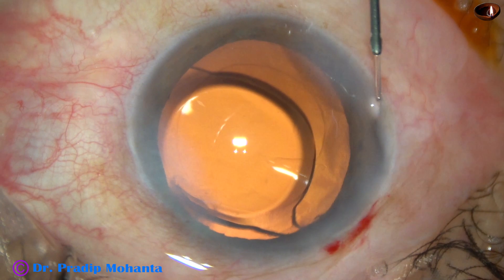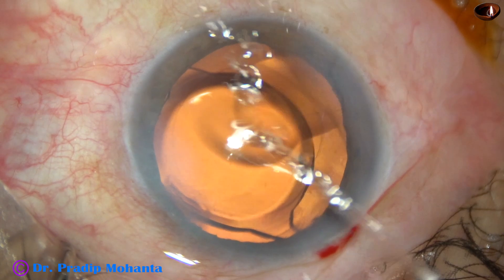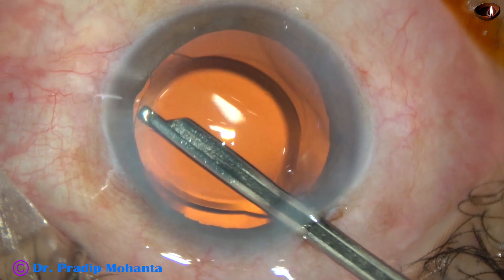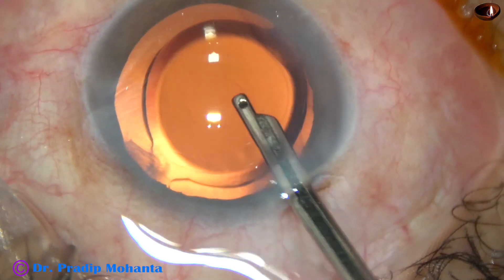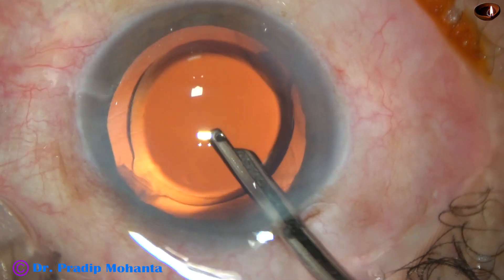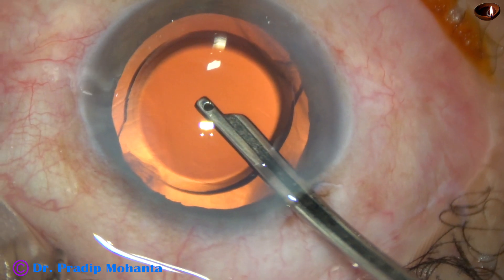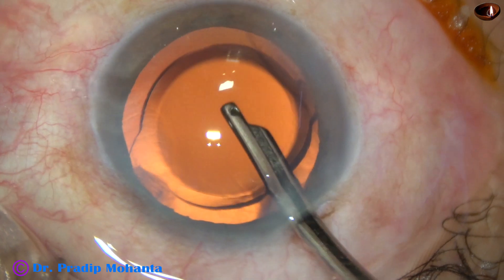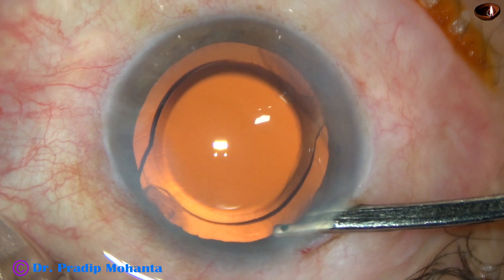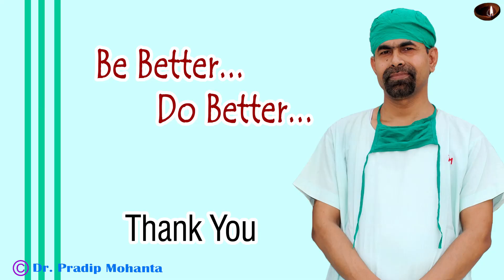I have no financial interest — I am just appreciating a good product. The side ports have been closed by corneal stromal hydration and this is the final lavage of the anterior chamber. I always do a final lavage of the anterior chamber and I have never found TASS — toxic anterior segment syndrome — in the last 10 years. I believe that is because of this final lavage. The anterior chamber is formed and the case is closed.